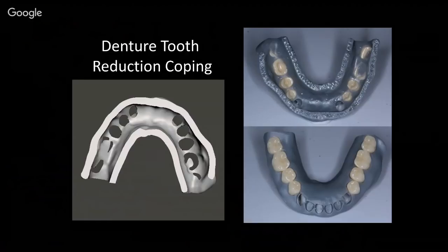And so this is awesome. It really simplifies this, and it makes it much more precise as far as where you're going to adjust. And so the way I do it is I roll out a little hot dog of sticky tack or silly putty or whatever. I make a U shape, and then I flip the denture over and I press that in, and that just keeps some pressure on the teeth from the underside to keep them pushed into the socket. And then I take a burr.